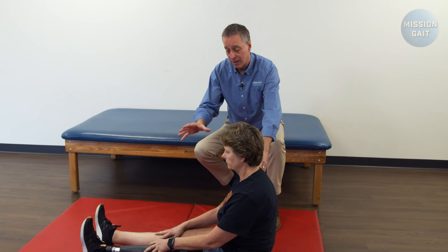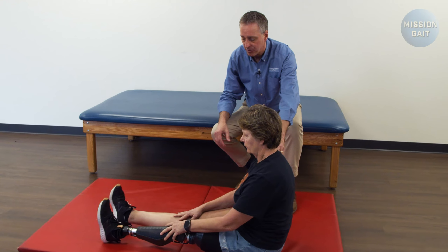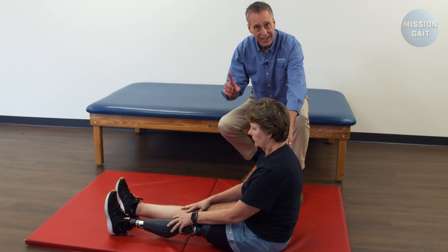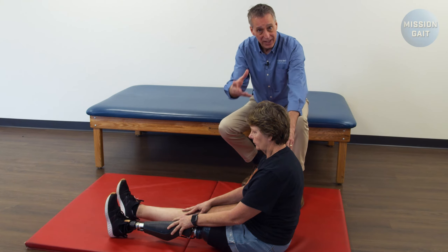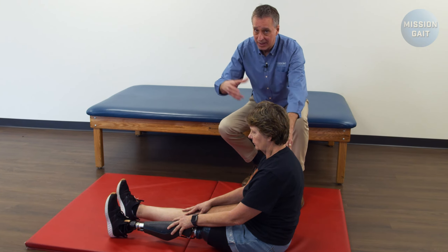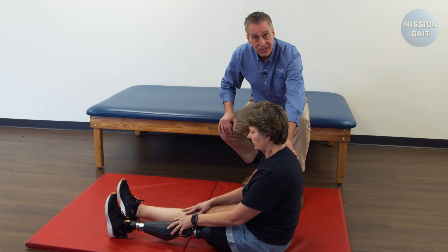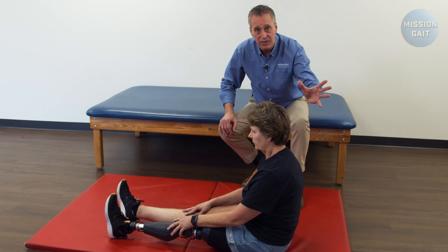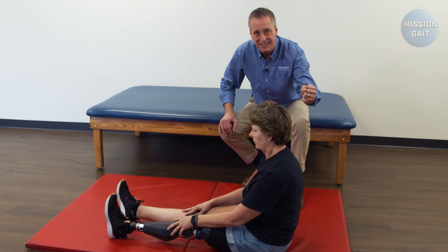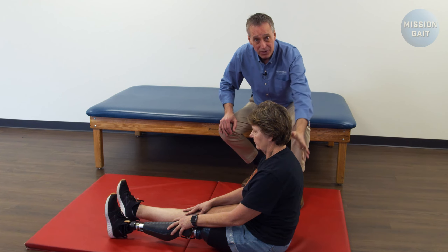In this scenario, we're going to look at a patient who has again fallen. They're looking at their feet to make sure both feet are facing straight up, then they're going to get to the position of power and get up with nothing to hold on to, but they do have someone around — a family member, a friend, or someone walking by. The key is, as the patient, to take control and direct the individual as to what you need, which is basically to be stationary and statuesque — don't move, don't pull on me as I'm trying to get up.